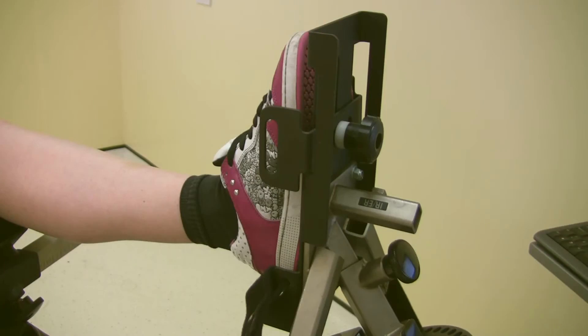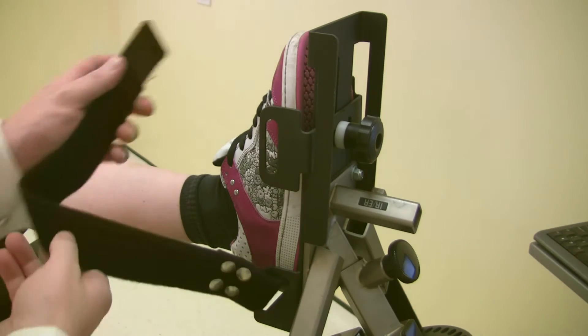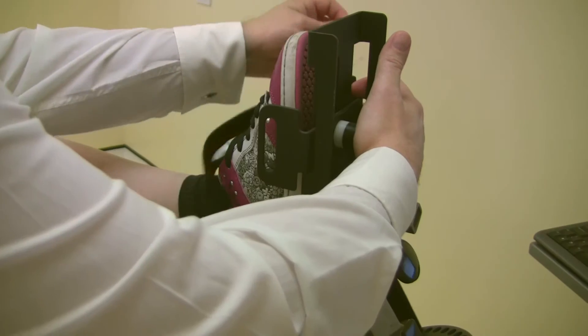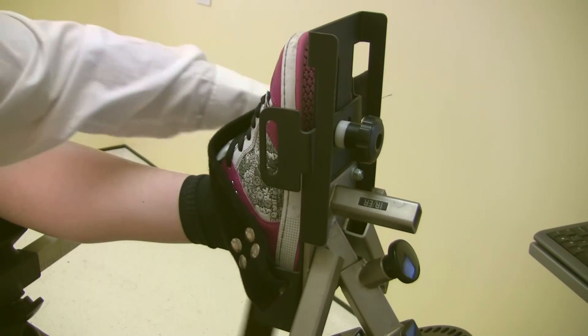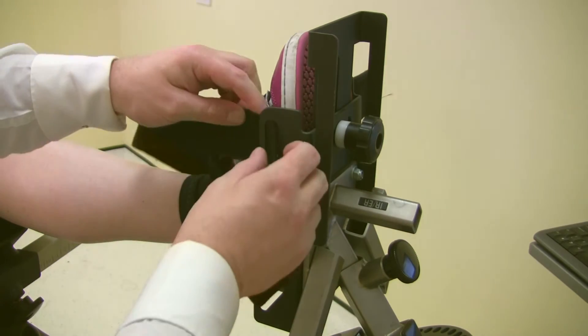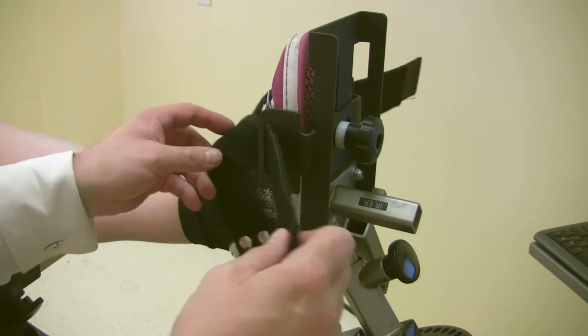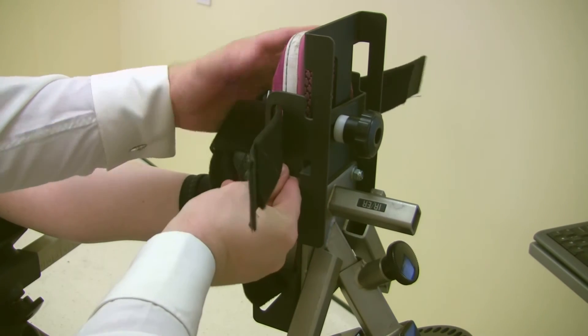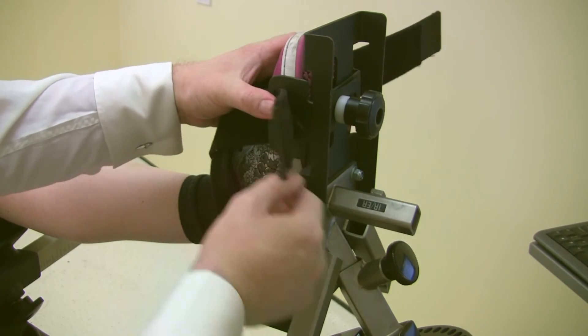To secure the foot to the footplate, start by loosely affixing the straps across the foot. Then adjust the strap points to the widest part of the foot. Pinch together.